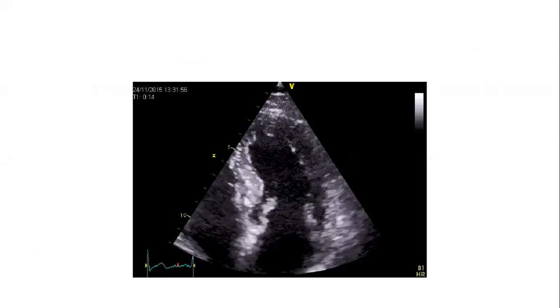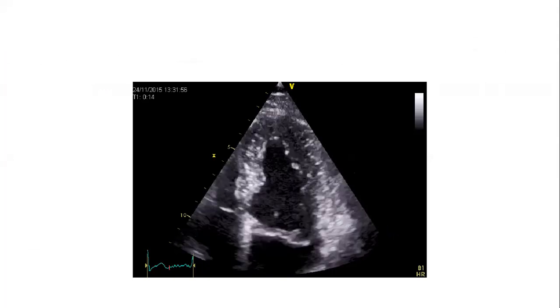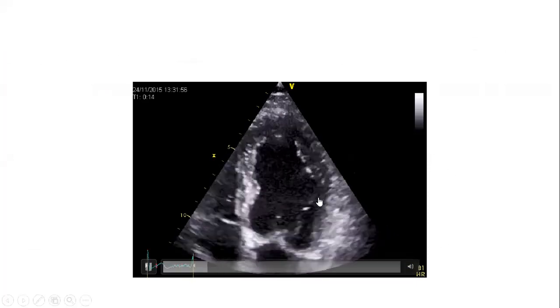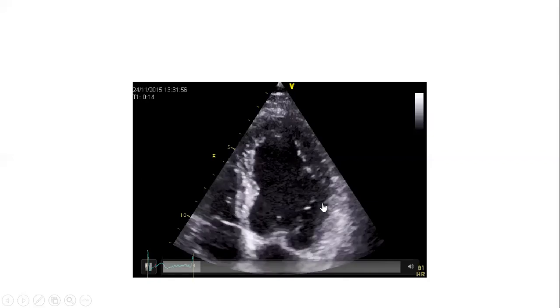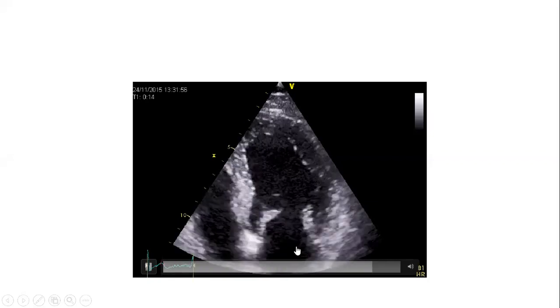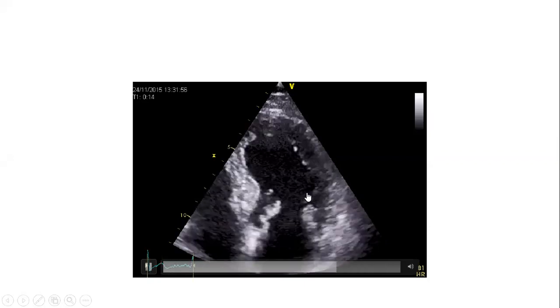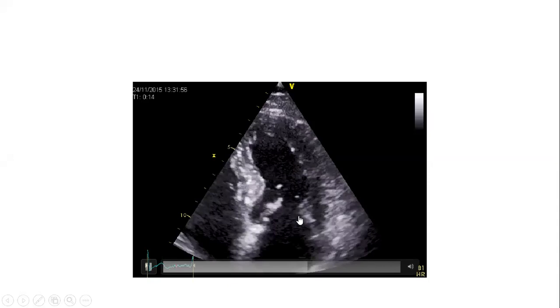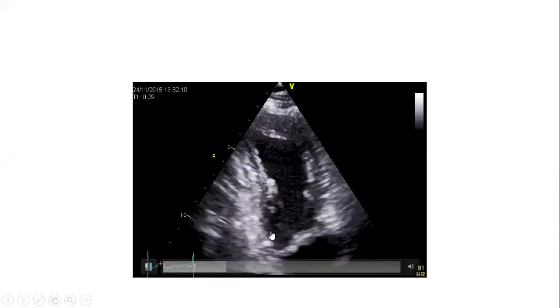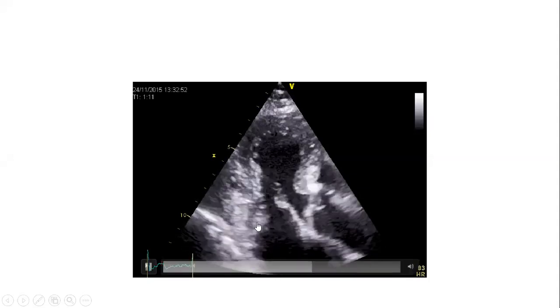So posterior wall of LV, sir. Basal infero-posterior lateral wall, right? Yes, sir. Look, this is lateral wall, mid-lateral, basal lateral, hypokinetic. And look at the bulging of this PML, because this cord has become looser now because of ischemia. If this is associated with basal inferior wall, again hypokinetic. Along with posterior wall, this is hypokinetic.